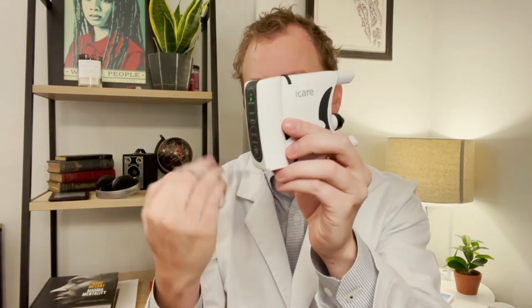And then it's nice to cover one eye, actually. I've been doing this a bunch of times, and you start to feel a little cross-eyed if you don't do it. So I find this is more comfortable. And then you also want to put your wrist strap on. And then you'll look right there. And then I'm going to hold down the top button. And then it doesn't even fire because it can tell it's too far away. 3 long beeps means that it's too far.